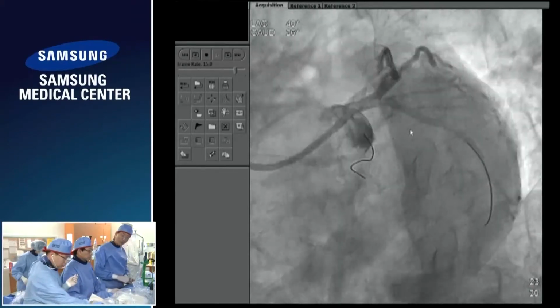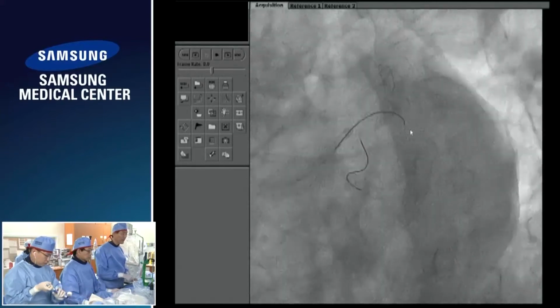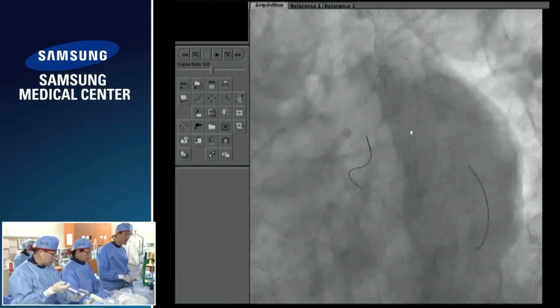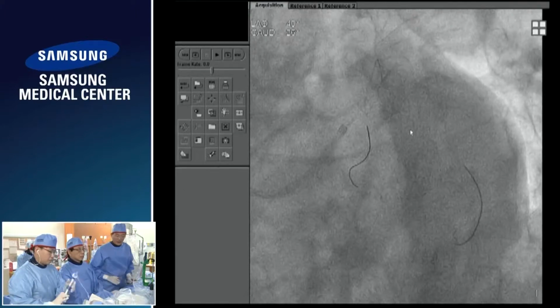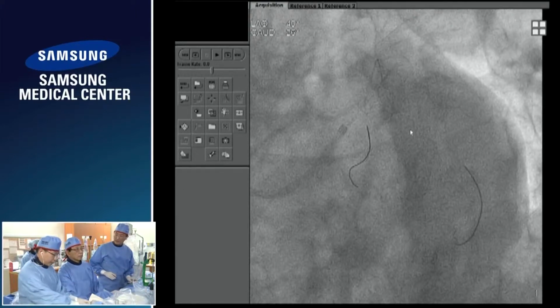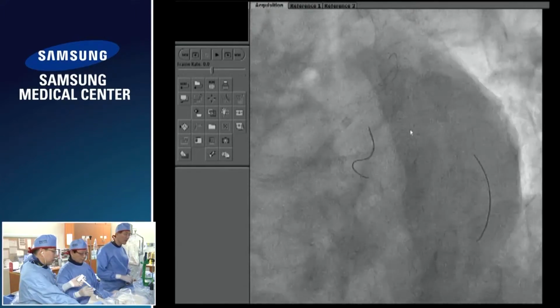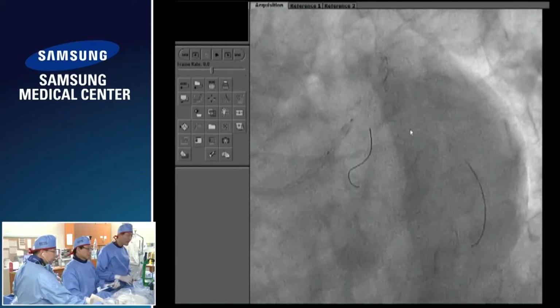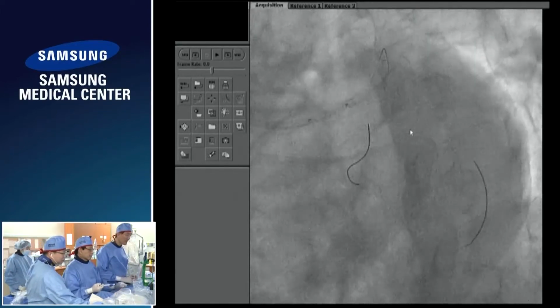This is a 3.5, 12 millimeter BVS. Actually, this is GT1. Oh, I'm losing the wire here. Okay, GT1, and the pushability of the BVS is improved. Basically, the shaft is the Zion's Alpine design, previously the Zion's V design. With this design the balloon is much more pushable, and hopefully it can cross the circumflex very easily. How about that? Oh, it's not that easy. Let's align the guiding catheter.